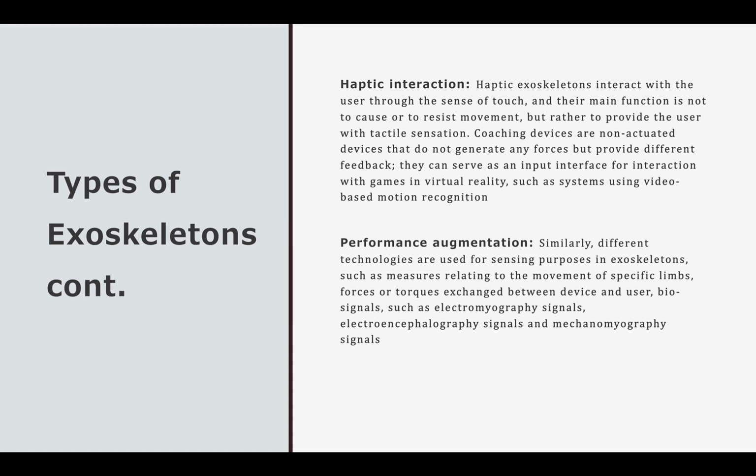Performance augmentation. Similarly, different technologies are used for sensing purposes in exoskeletons, such as measures relating to the movement of specific limbs, forces or torques exchanged between device and user. Biosignals such as electromyography signals, electroencephalography signals, and mechanomyography signals.